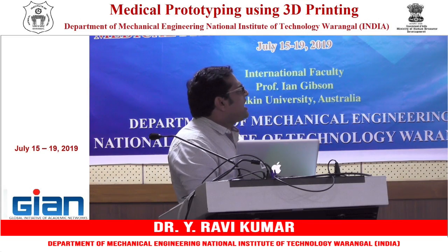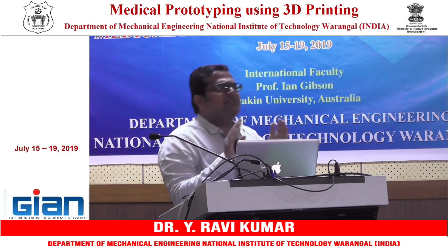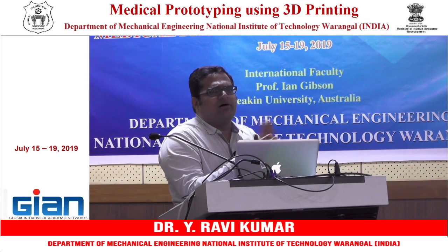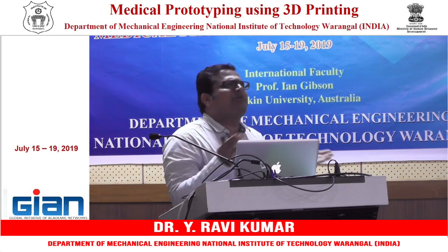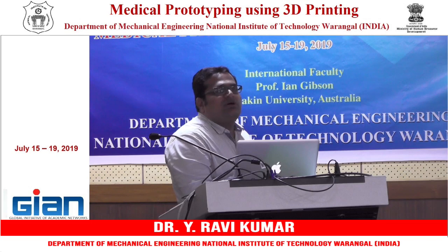Then you have a virtual model, and to some extent a surgeon can plan some surgery or do a bit of rehearsal on the computer, not on a physical model. It need not be a physical model every time; maybe a virtual model is also sufficient.